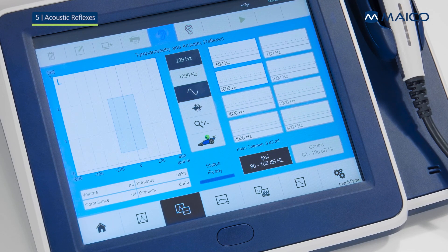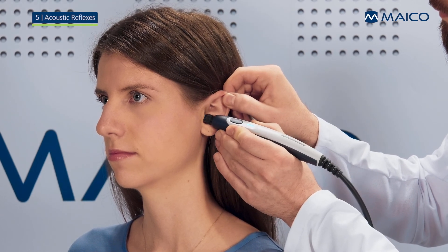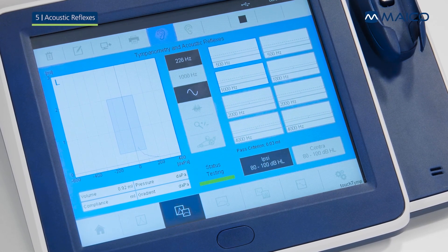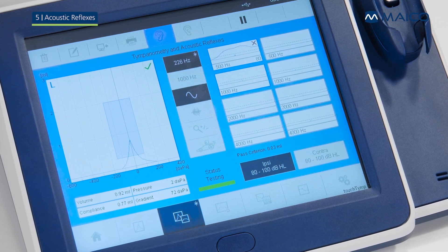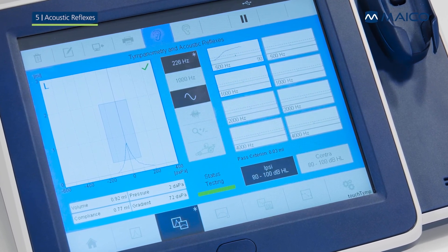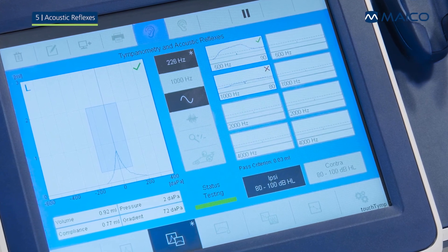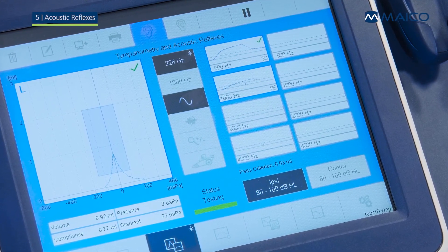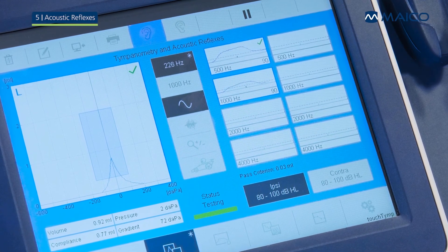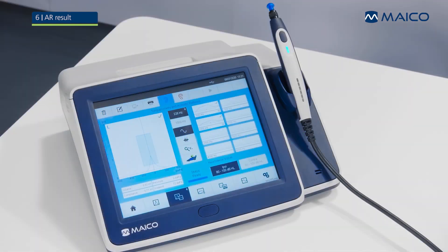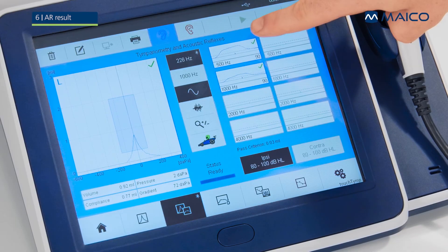The measurement starts automatically once the probe is properly placed in the ear. Otherwise, please press the play button for manual operation. At the conclusion of the test, the result symbol appears at the top right corner of the box.